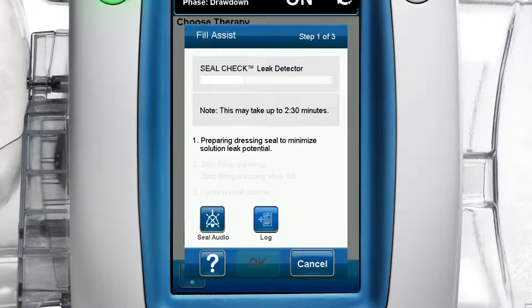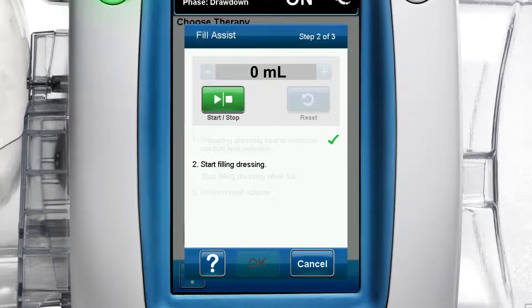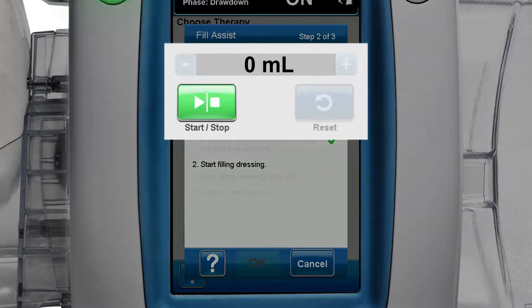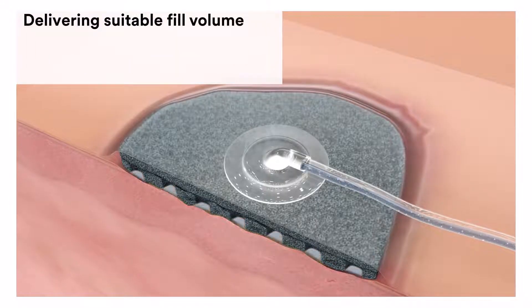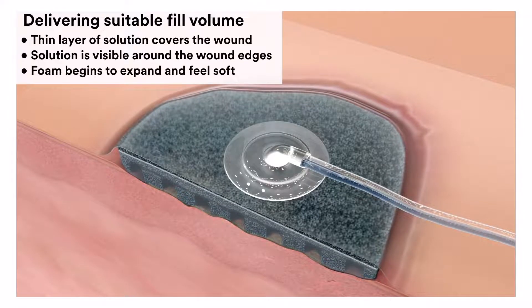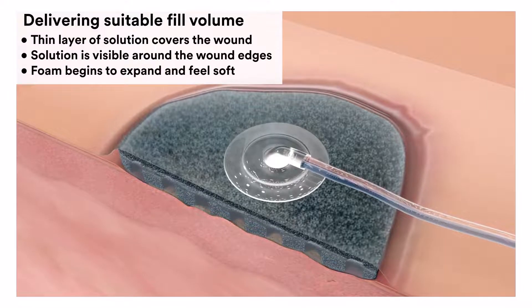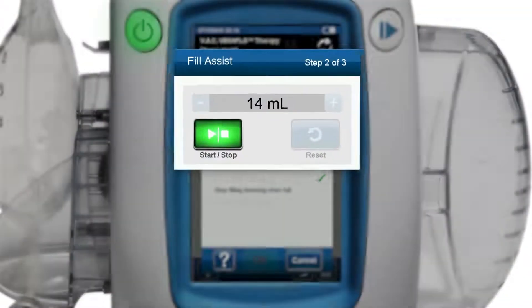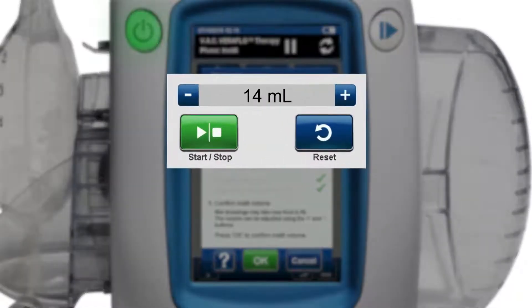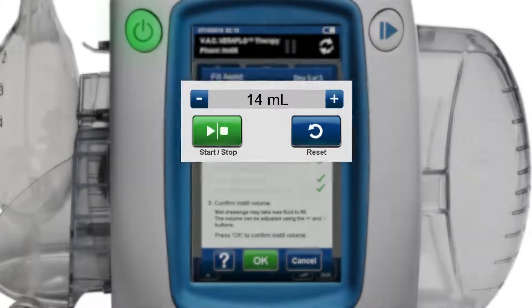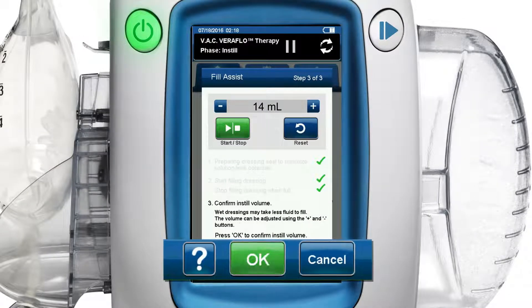Once a good seal is confirmed, step 2 of 3 appears: start filling dressing. On the fill assist step 2 of 3 screen, press the green start/stop button to begin delivering solution to the wound. Monitor the wound as it fills with solution. Once a thin layer of solution covers the wound, is visible around the wound edges, and the foam begins to expand and feels soft, press the start/stop button to stop filling. Now step 3 of 3 of the fill assist screen appears, awaiting confirmation of the volume setting. Because wet dressings may take less fluid to fill than dry dressings, consider reducing the volume 10 to 20% by using the plus and minus buttons before pressing the OK button to confirm your fill volume and move to the next screen.